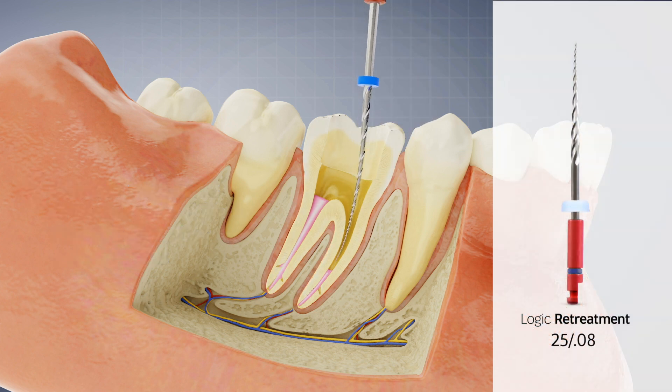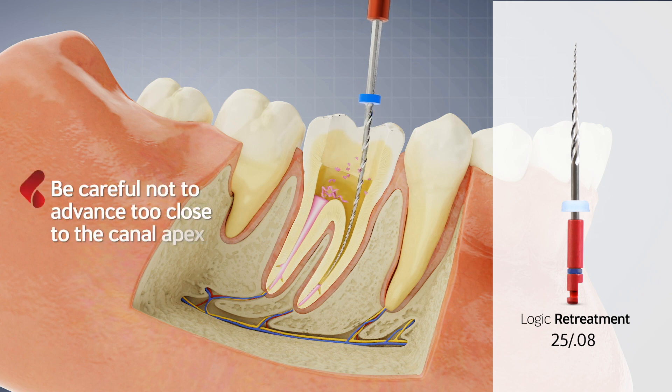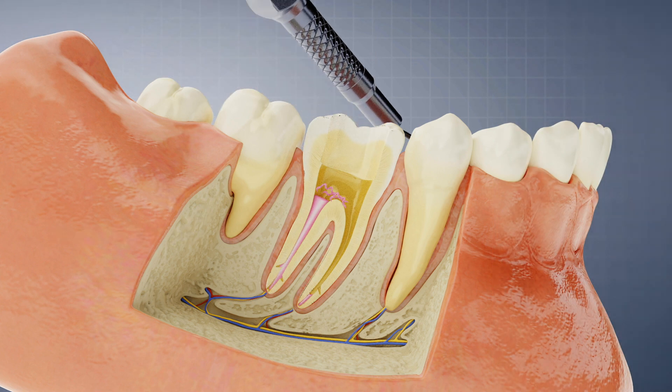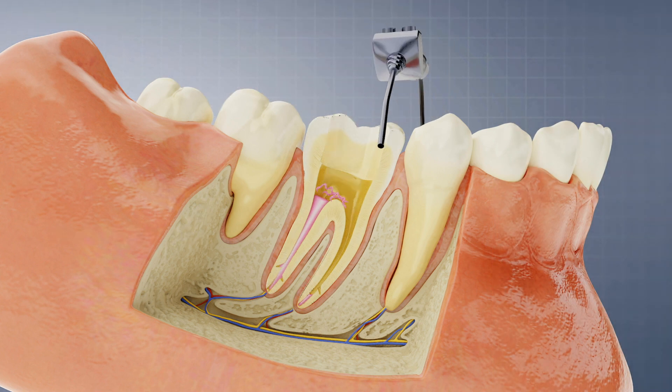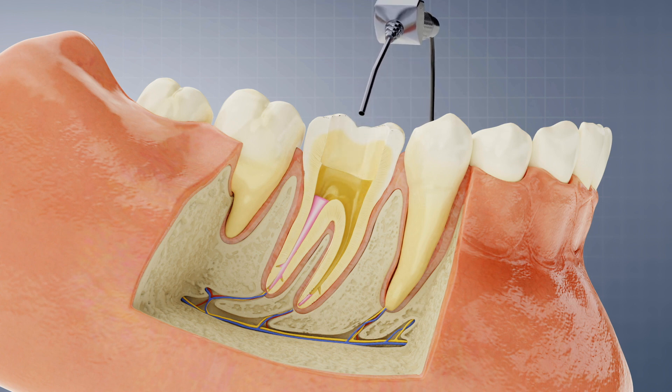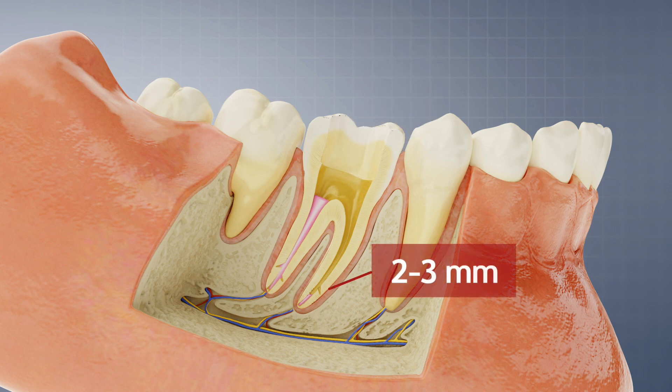Next, use the 2508 with the same procedure without advancing too close to the canal apex. By this point, about 90% of the gutta percha should be removed, leaving only the last two to three millimeters of the apical region.